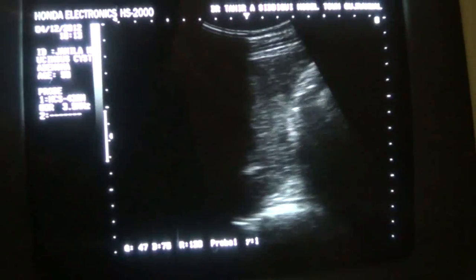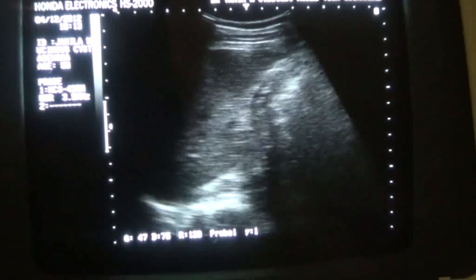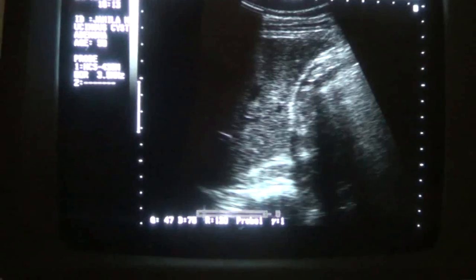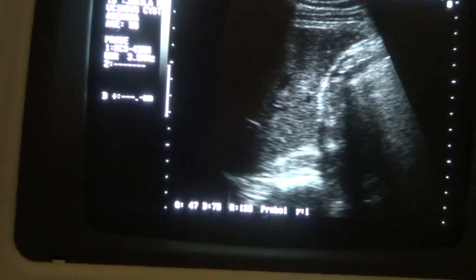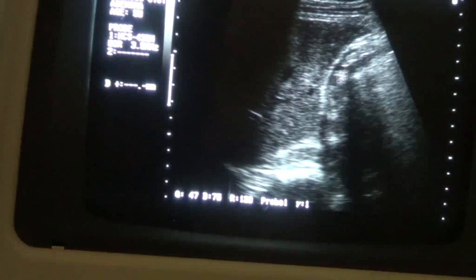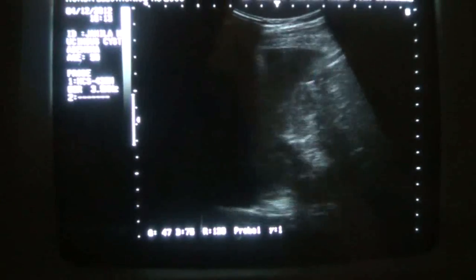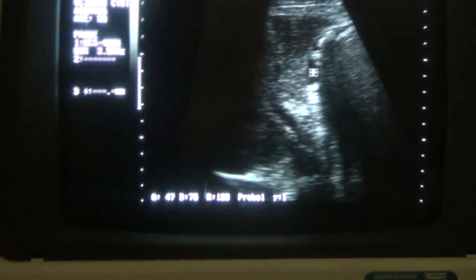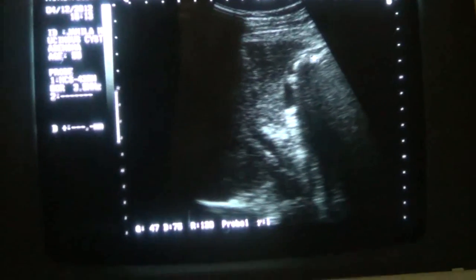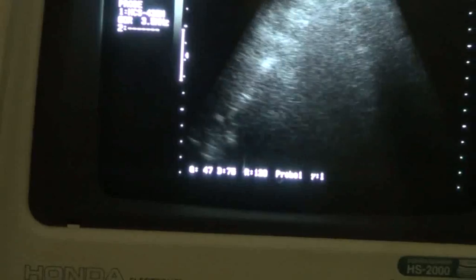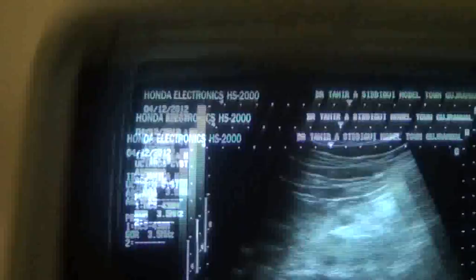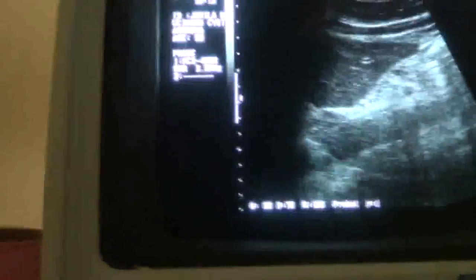It is not unusual to see biliary pathology associated with this sort of pathology. This is the gallbladder, and these are the calculi within it. Here you can see the landmark for the gallbladder — this is the portal vein at right angle from the neck of the gallbladder. No para-aortic lymphadenopathy is seen.